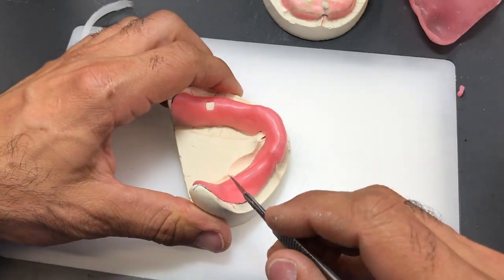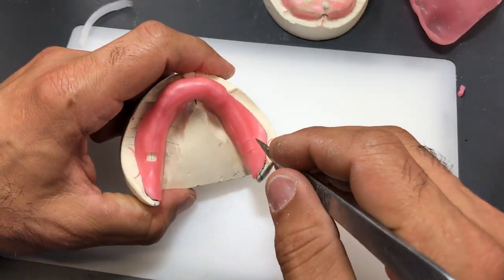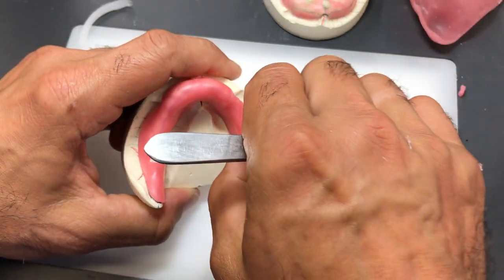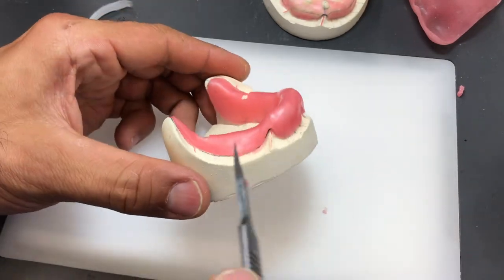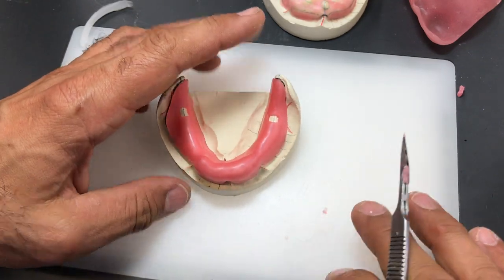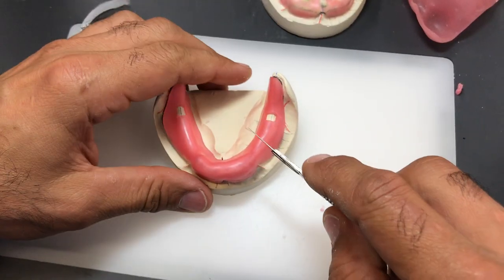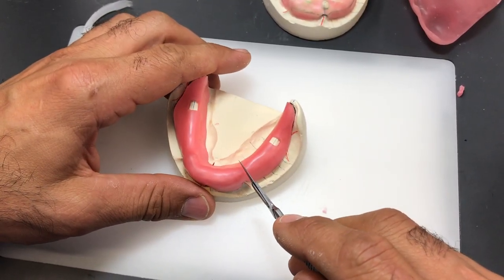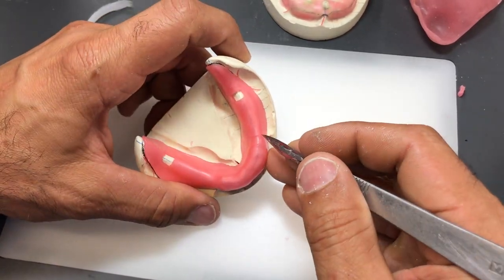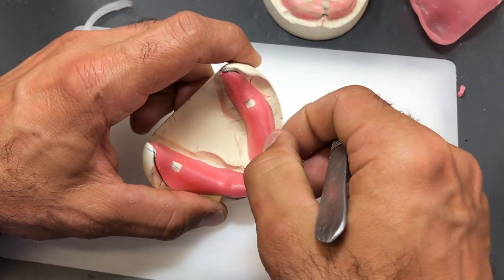So I'm going to do one on each side. You want to go back as far as you can without cutting or establishing this tissue stop on the incline portion here. So I'm just before the incline. I want to spread these tissue stops as far as I can. And I'm going to do two more. One around the three, or somewhere between the three and four area, between the canine and the first bicuspid. Pull that out.